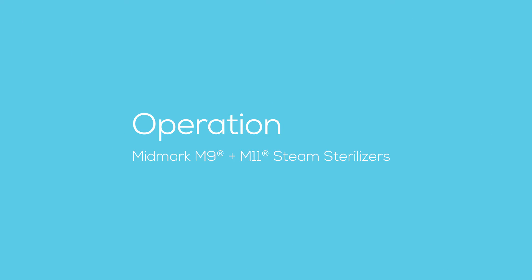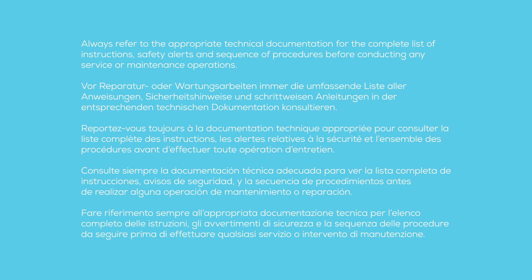This video provides an overview of the operation of the Midmark M9 and M11 steam sterilizers. Always refer to the appropriate technical documentation for the complete list of instructions, safety alerts, and sequence of procedures before conducting any service or maintenance operations.